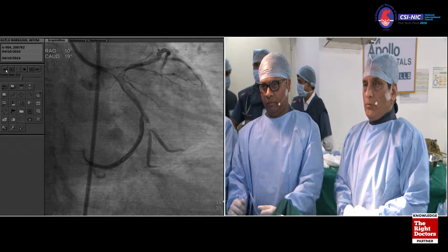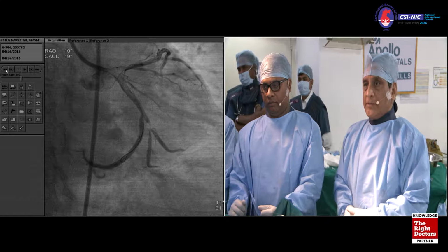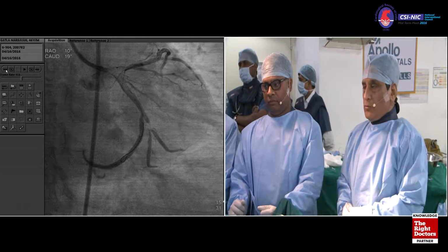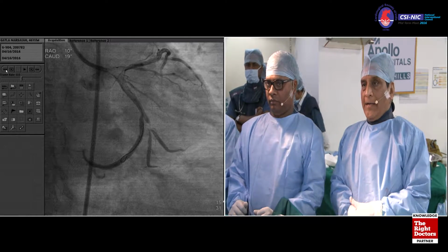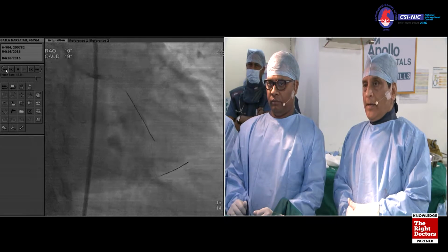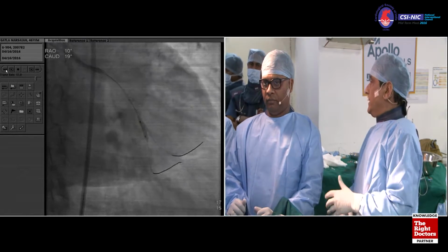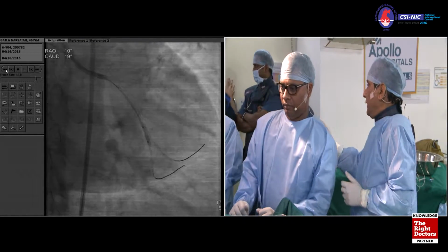We are actually ready to do an intervention of this bifurcation lesion, and of course we can take the opinion from the panel. Should it be a 1-stent approach or a 2-stent approach? But we'll just show you next that we did a balloon dilatation, and then we did the OCT, and Dr. Manoj is ready to show the OCT here. Can we show the OCT?